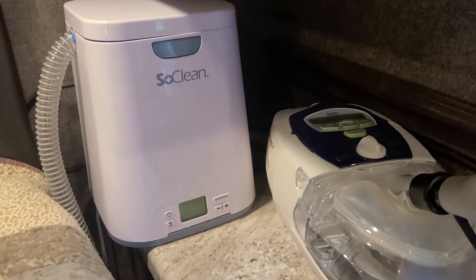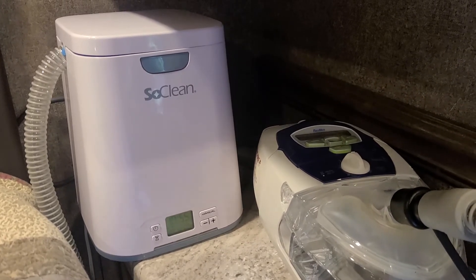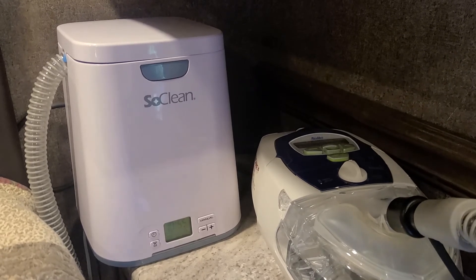They're a little spendy, but they're well worth it, in my opinion. Since I've used this item, I've never been sick or gotten any kind of cold from not having a clean mask.